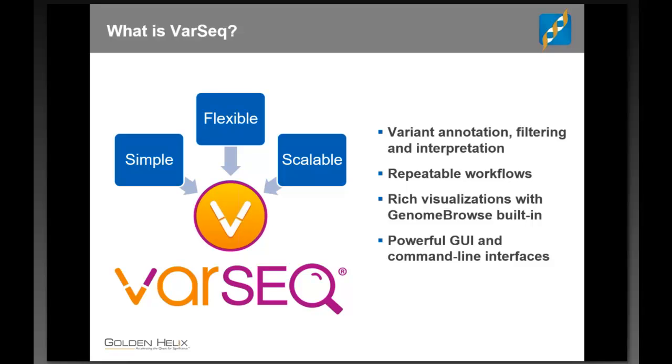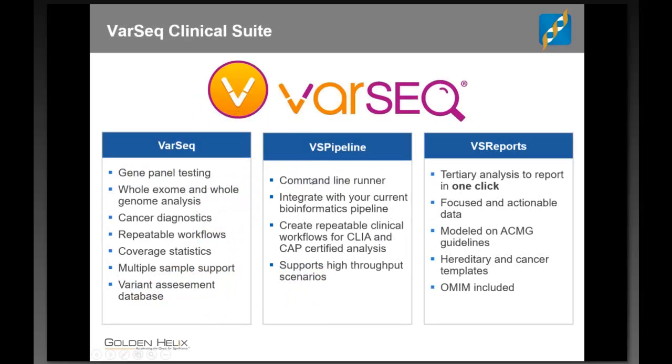And in fact, we've built VarSeq to do that. We launched it the third quarter of last year. It has all of these features, including our rich visualization engine, and now with VS Pipeline, which I'll talk about at the end, a command line interface. In fact, I'll talk about it in the context here. So this is now what we're able to provide as a clinical suite for this final and important step.